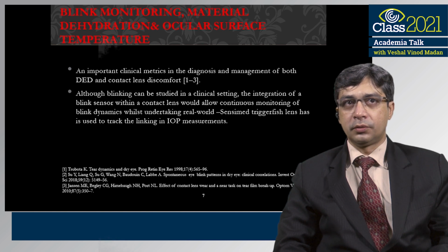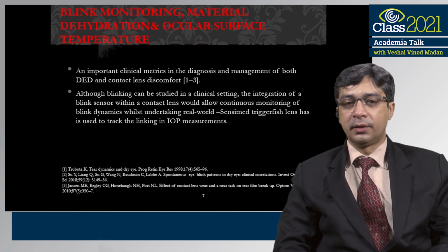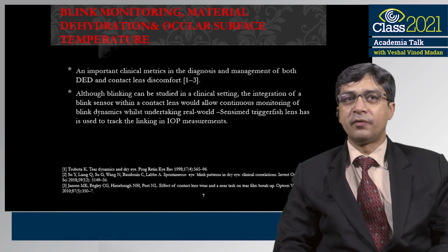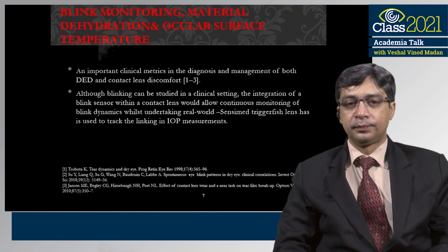Lenses like Triggerfish can be modified for monitoring as well as aiding in correction of the blink rate for people who have a reduced blink rate, as is very commonly seen in people who are in front of monitors and other visual devices.